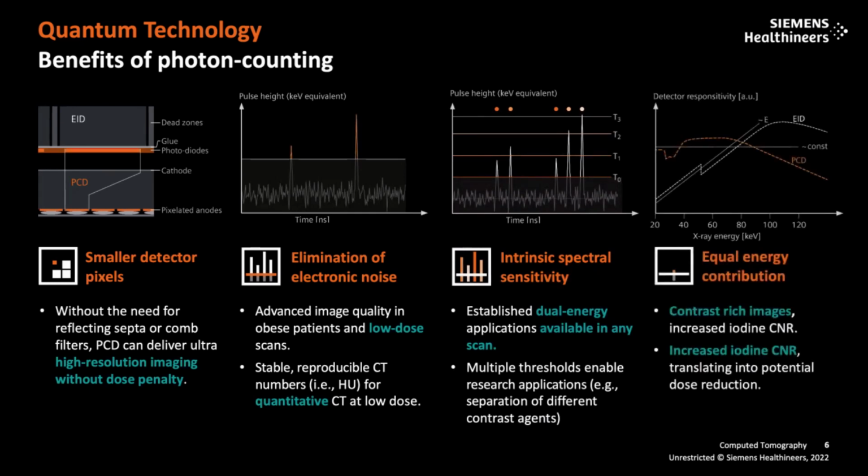And we get an equal energy contribution. Because of those improved detectors, we're getting more of a uniform energy contribution, which allows less image noise, smoother images, and theoretically more diagnostic accuracy.